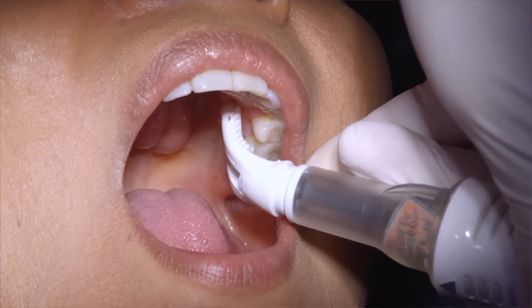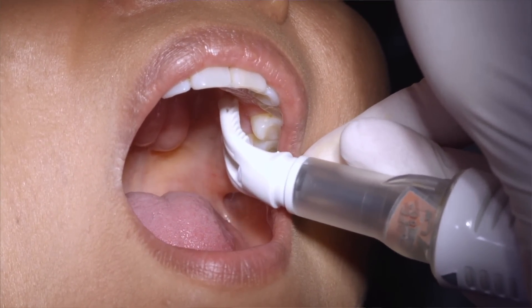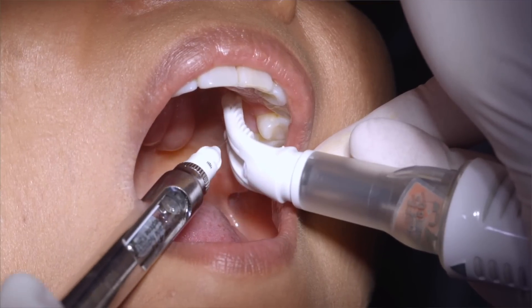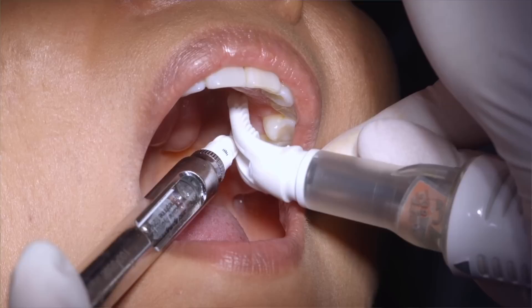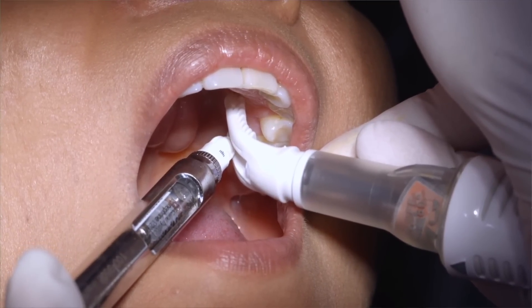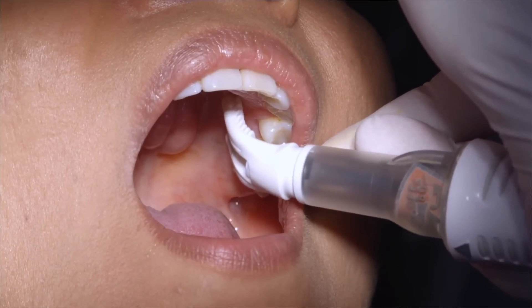Vibrate the tissue you plan to inject for a range of 5 to 10 seconds. Slowly administer local anesthetic. Once the injection is completed, vibrate for a few seconds after and remove the Dental Vibe.